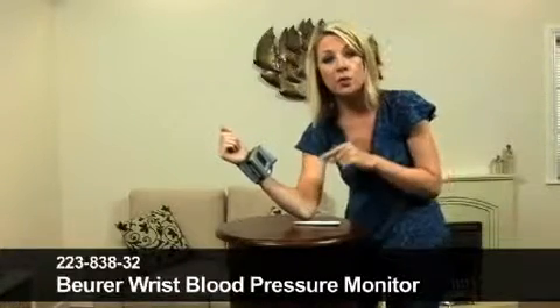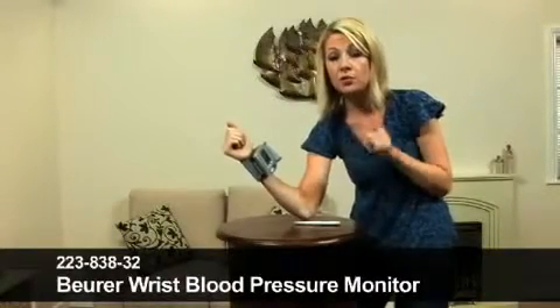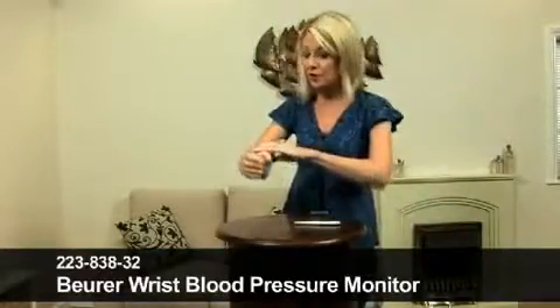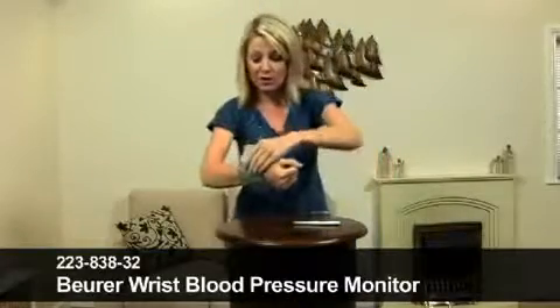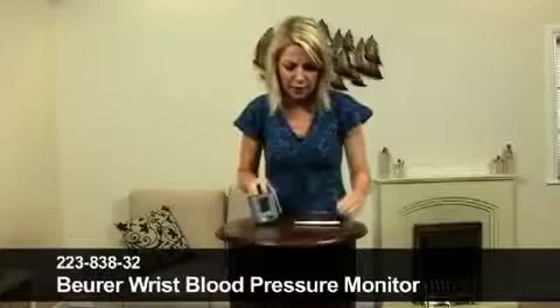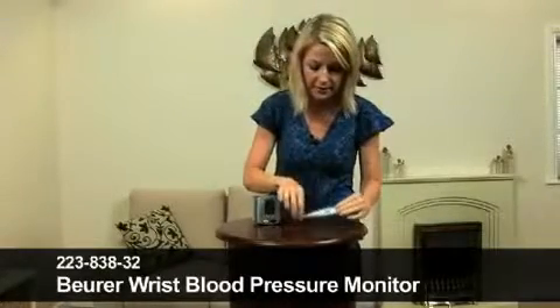What's great is when you order the blood pressure monitor, you also get the digital thermometer absolutely free, which is just great, isn't it? What more could you ask for? I'm going to pop this off and place it back down on the table, and we'll have a little look at the digital thermometer.